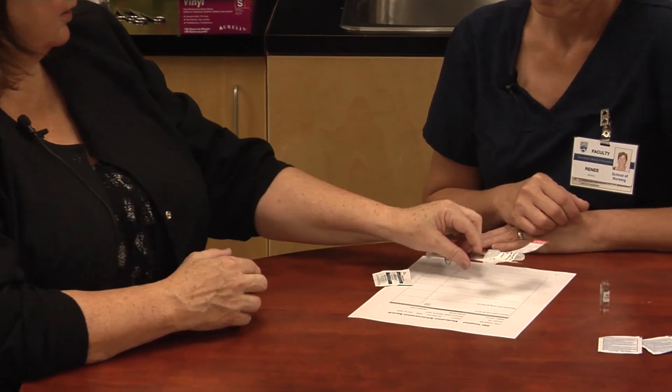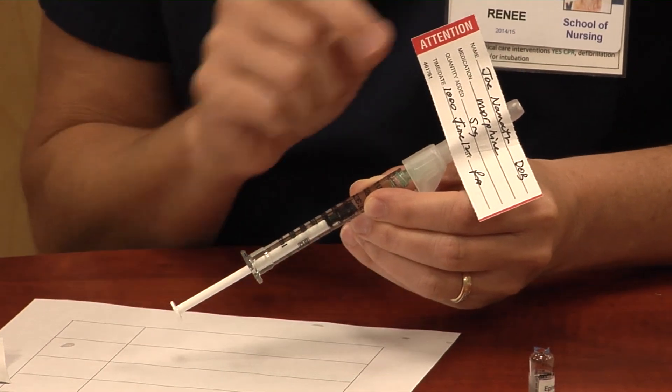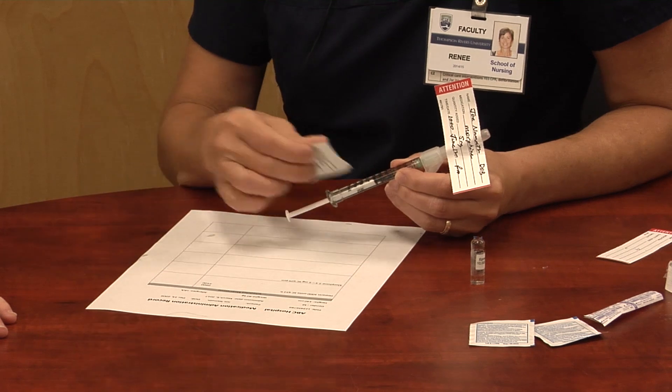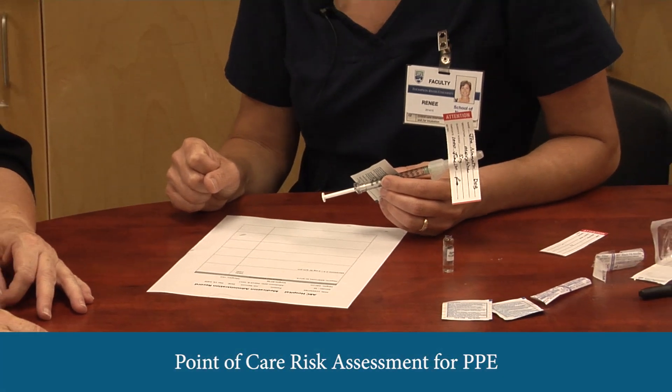For label placement, some people put it on the barrel, some on top — it comes down to preference, but it's important to be able to visualize the volume to confirm you have the full dose at the bedside. Before going to the bedside, take the drug, the MAR, and an alcohol swab. Regarding gloves, it's about point-of-care risk assessment: the risk of blood exposure during a subcutaneous injection is low, but if the patient is on anticoagulants your risk is higher, and you're never wrong to be more safe.